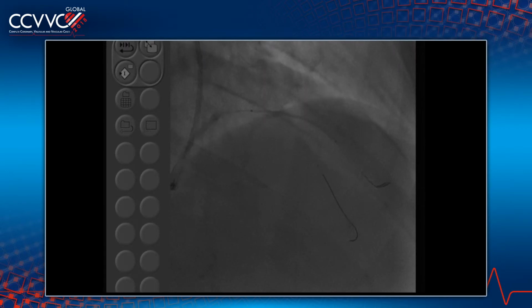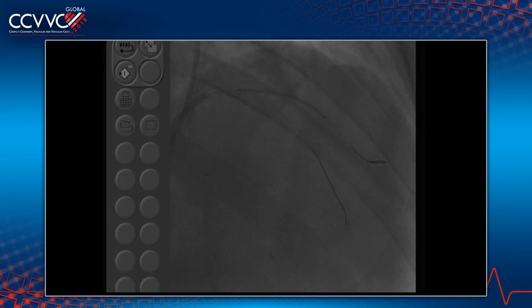Are they showing the app there? Yeah, we can see it. Yes, we all see it very well. Don't worry, it looks nice. You're going to show us the case and the diagonal first.